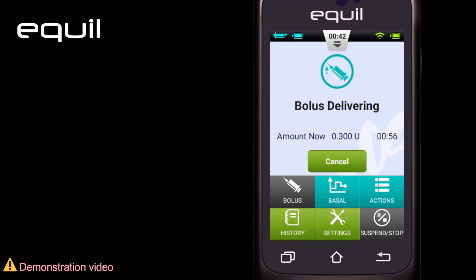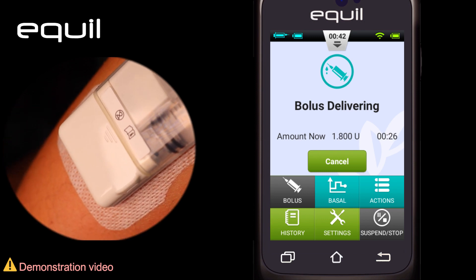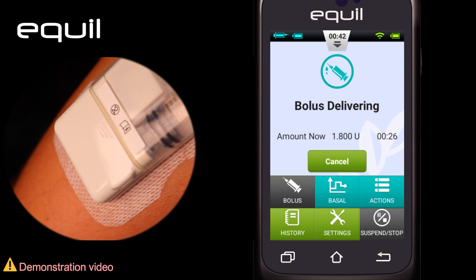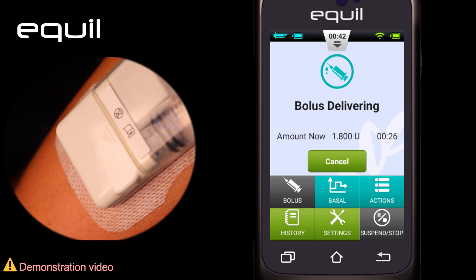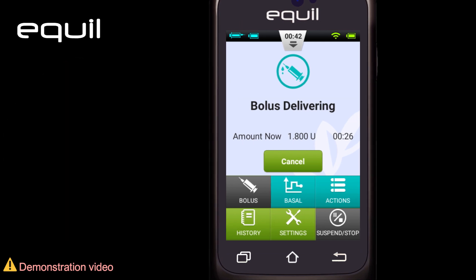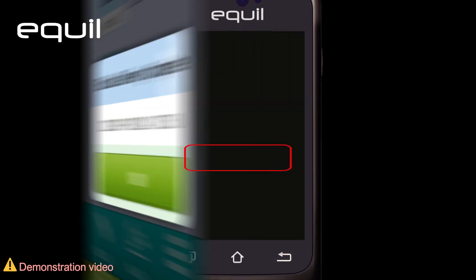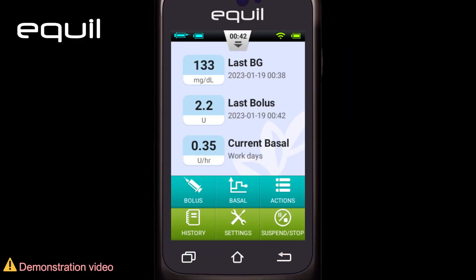The bolus can also be cancelled directly from the pump. On the pump, press and hold the quick bolus button. You will receive audible confirmation from the pump and the bolus will be immediately cancelled without further confirmation — only a pop-up dialog box will appear with the administered bolus details. Note 1: canceling bolus delivery will cancel the total bolus, the amount now, and the extended amount.